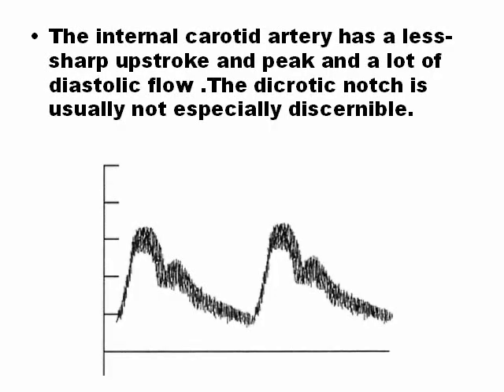The internal carotid artery wave is very different. It's round, it's not peaky, and has a high diastolic flow. That is because the internal carotid artery is a low resistance artery. The brain always needs blood, unlike muscle, and for that reason there is a lot of flow in the end diastolic area of the wave.